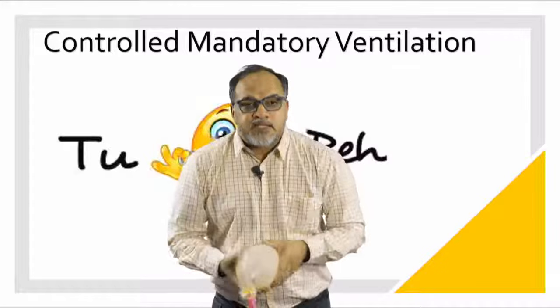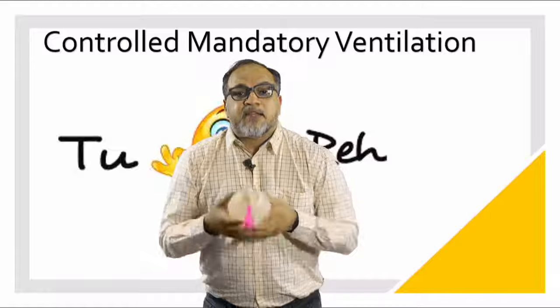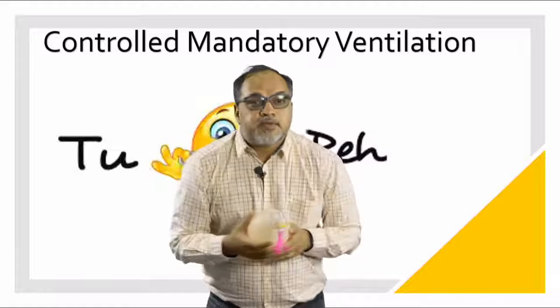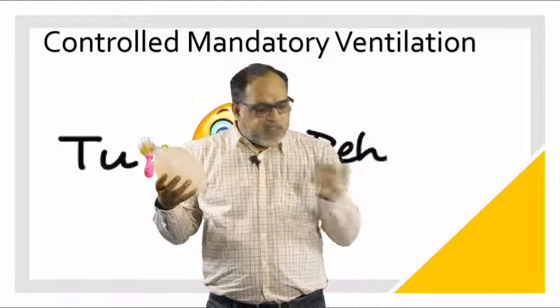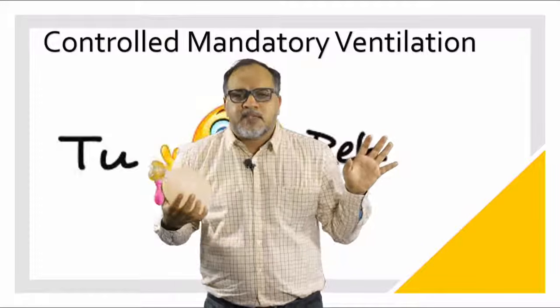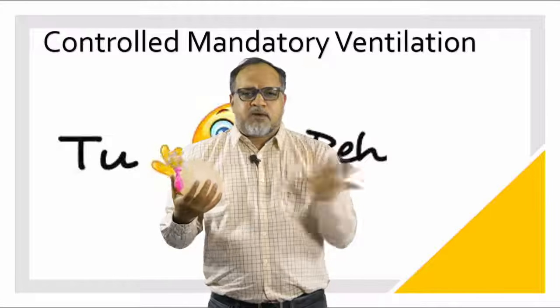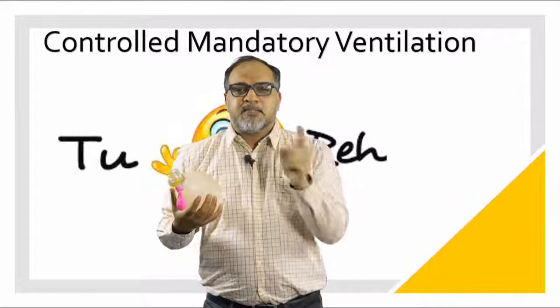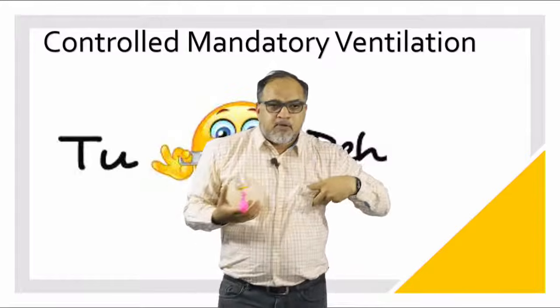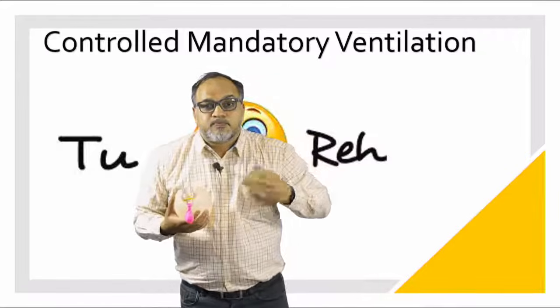This mode is called controlled mandatory ventilation, CMV mode. What is CMV? That everything is controlled by the ventilator. There is no respect for the patient's wishes. If he wants to breathe in, breathe out, I don't care. I'll give whatever I have been told because I'm a 10th pass student. Fine. Now what do you do?